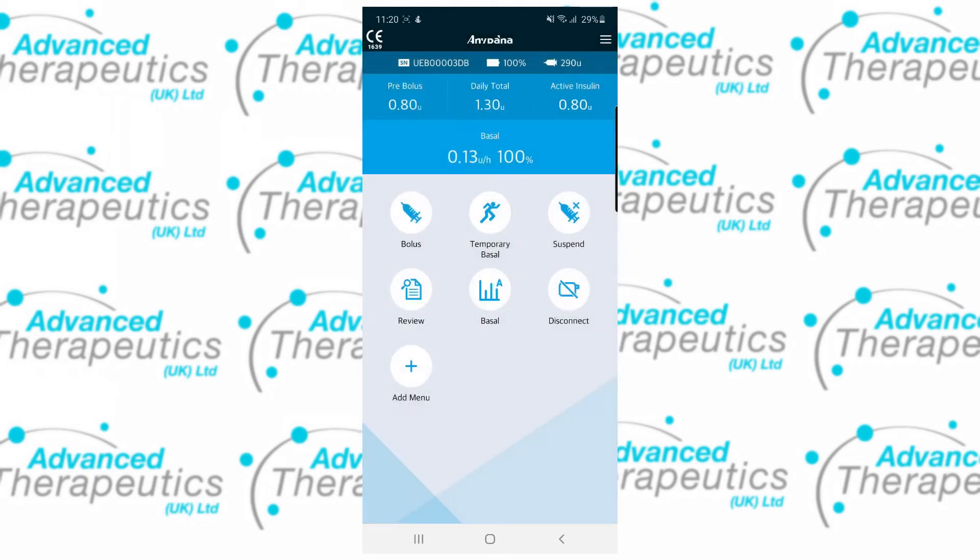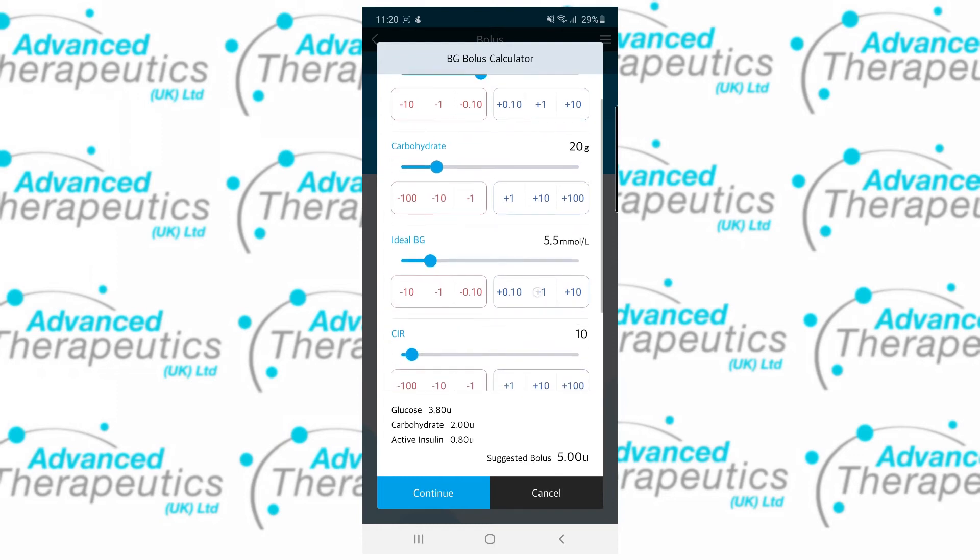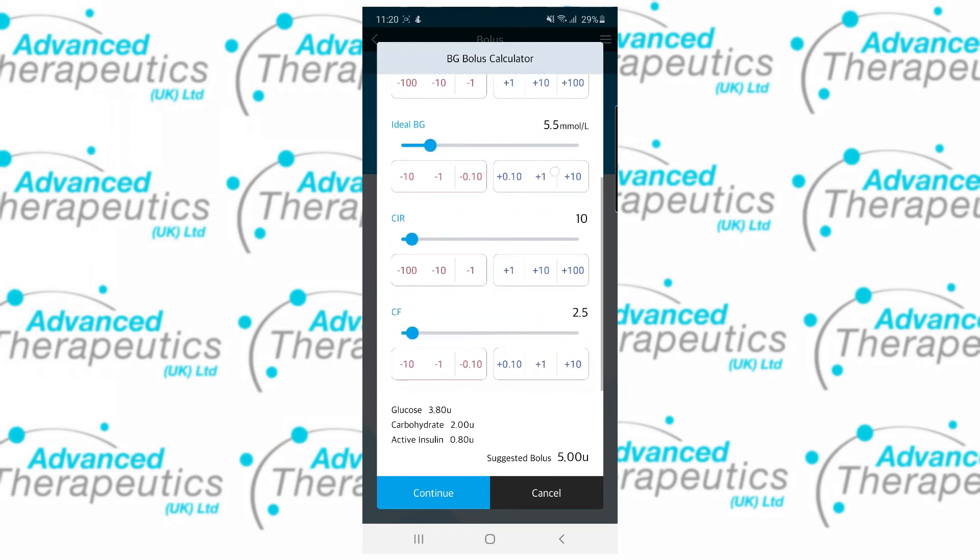You'll now see that the home screen has reflected the bolus just delivered, as well as your active insulin. We can always use the BG bolus calculator to perform both a corrective and carbohydrate bolus, again from our phone. You can also set custom targets and edit your ratios from within the calculator for added flexibility.